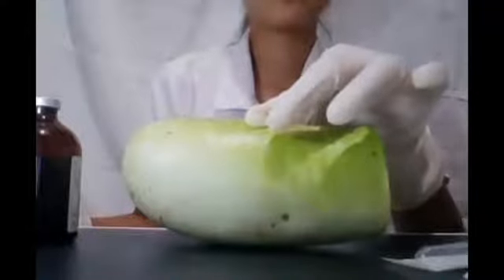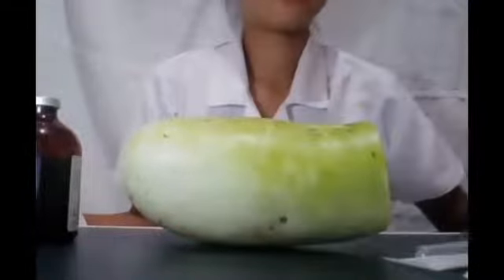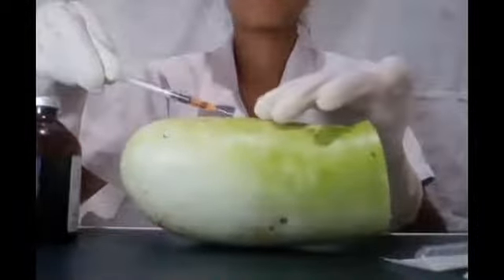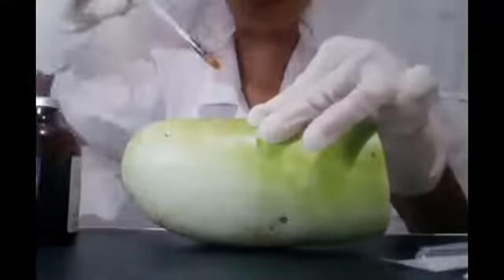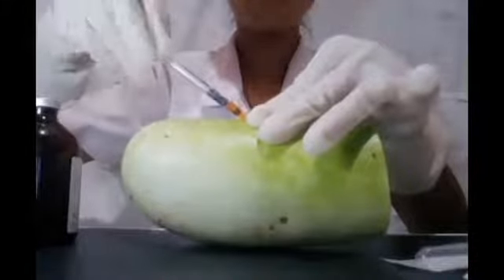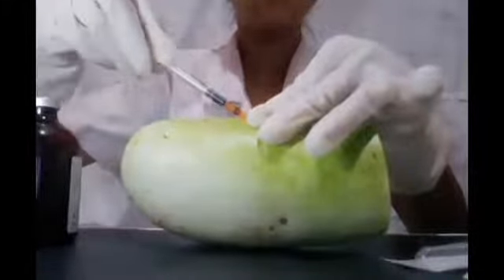So first we're going to wipe it off with our alcohol wipe, and then we're going to go at the 45 to 90 degree angle and inject. Pinch, and inject, and then let go, and then discard your sharps in the container.